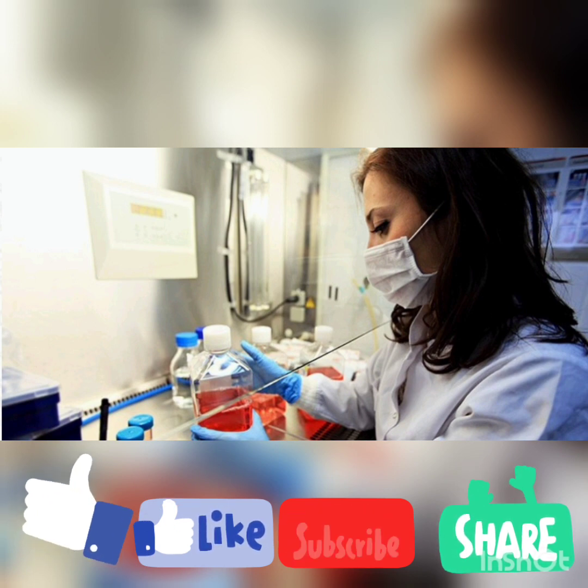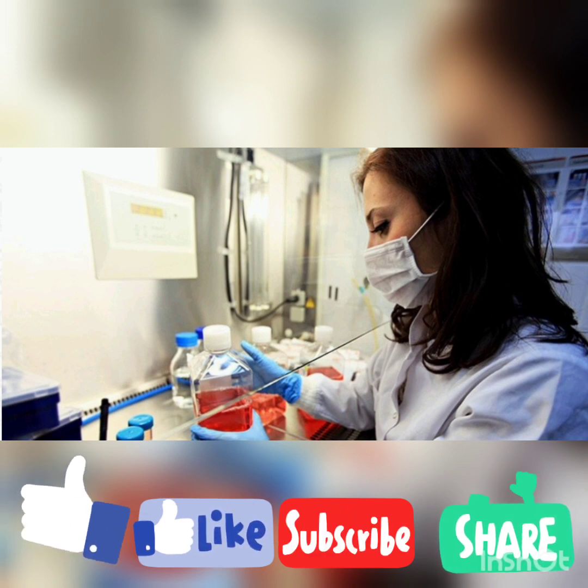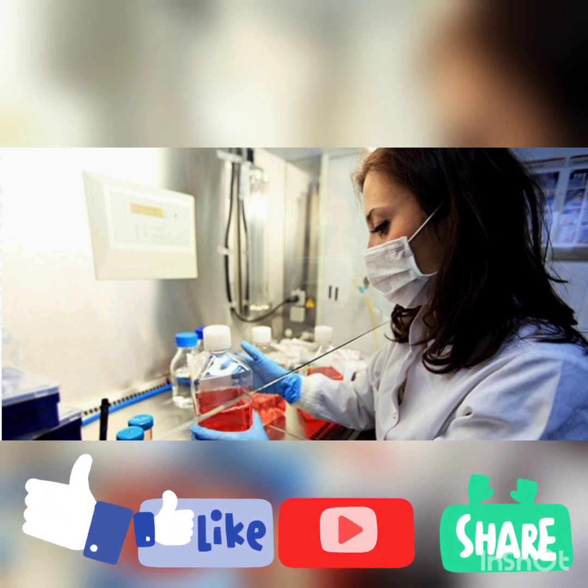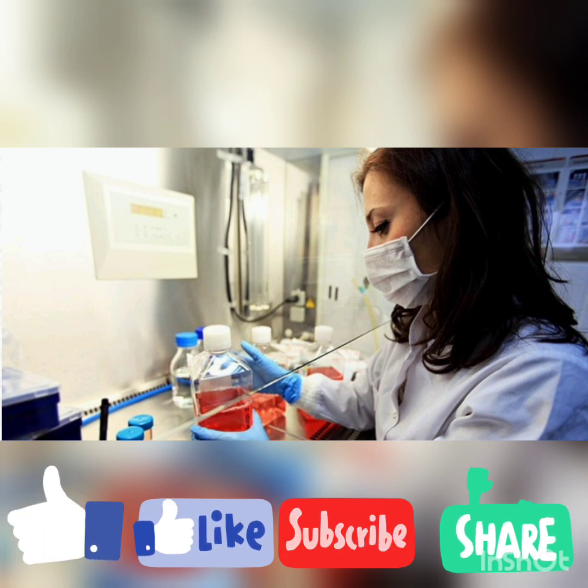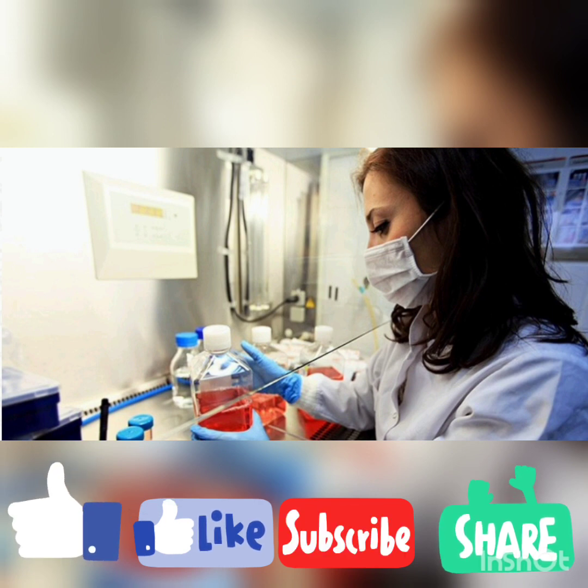And the specimens which are submitted for isolation of a virus need to be frozen immediately. They need to be kept in a freezer. But specimens of clotted blood for a virology study, to study virus in the blood, you can keep in a fridge. You should not keep it in a freezer, but you can keep it in a fridge at a temperature of 4 to 6 degrees centigrade.